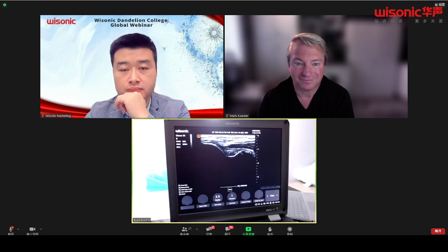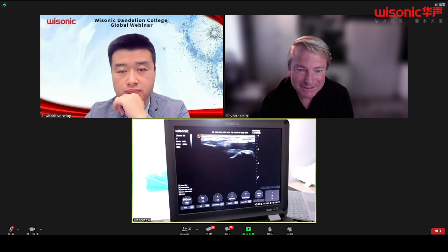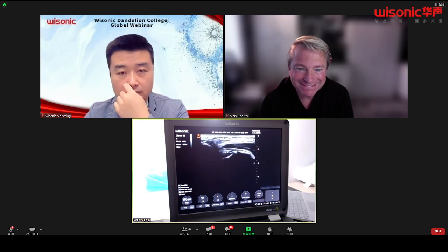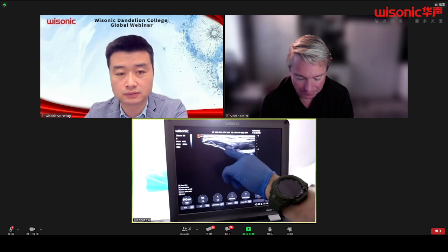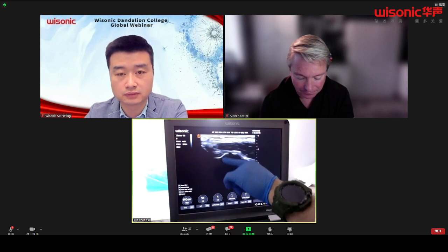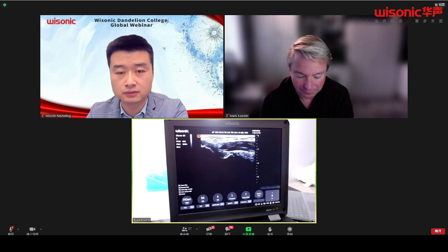Tim, can you confirm or deny any kind of injury to your medial elbow? I can confirm without a doubt. Okay, so we get live pathology here, guys and gals. So it looks like we have a UCL, probably a pre-existing UCL tear right in through here. Let's follow that over to the sublime tubercle. You can see this little nodule off the top here. And we'll be nice to him. We'll do a nice and easy exam.